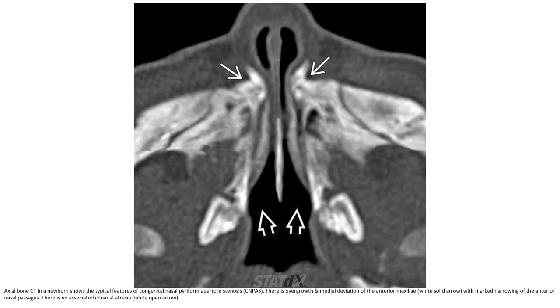This is the axial bone CT in a newborn. The typical feature of congenital nasal pyriform aperture stenosis is overall medial deviation of the anterior maxilla with marked narrowing of the anterior nasal passage. There is no associated choanal atresia.